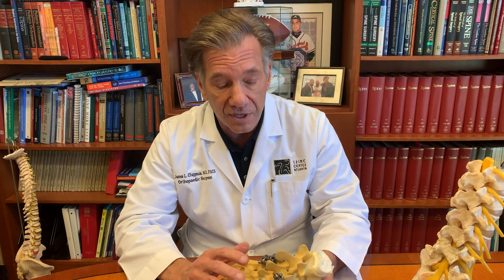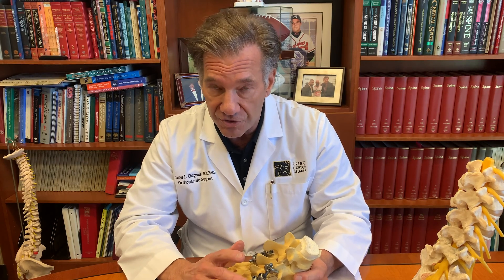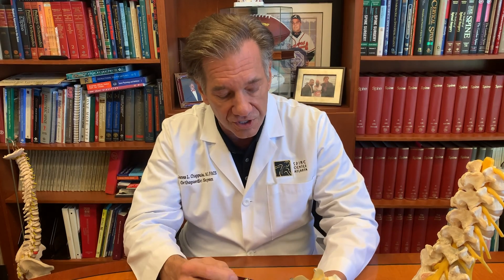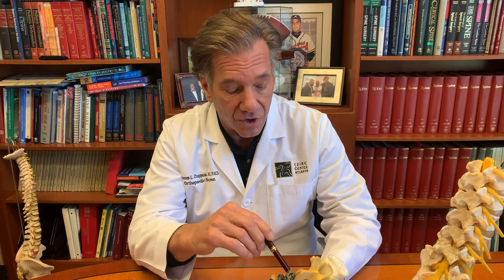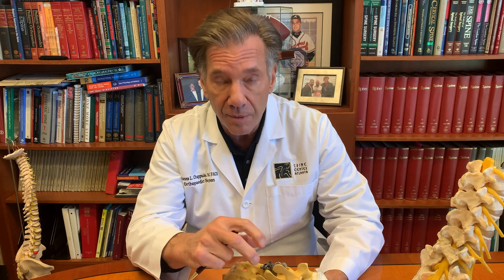If your fusion is done from the back, generally your surgeon will do what's called a TLIF or PLIF procedure. A TLIF is called a transforaminal lumbar interbody fusion. When he does the decompression and opens this up, he puts the interbody device through the neuroforamen and into the interbody space — usually one on one side, which could be horseshoe shaped to take up more surface area, or on each side, which would be called a PLIF, or posterior lumbar interbody fusion. After those devices are put in, bone graft is placed in the center, and then pedicle screws are put in to stabilize everything.